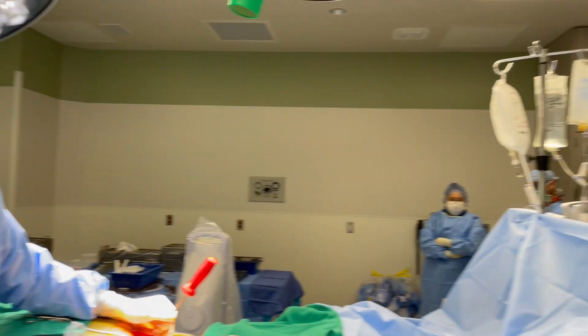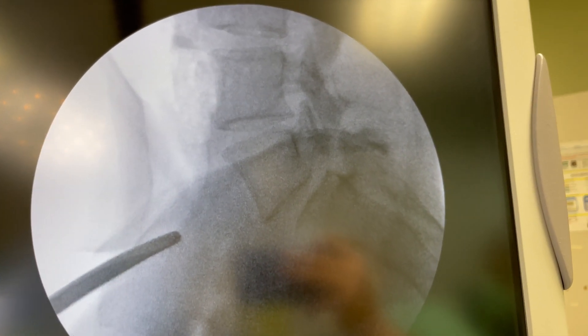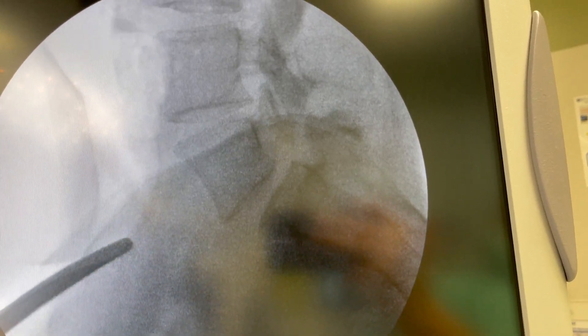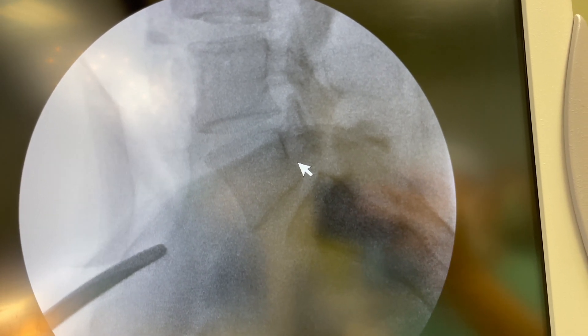The first image shows what happened when we first started. You can see that before we put any bone graft in the front and any bone screws in the back, the bone is actually shifted forward — shifted forward compared to the back of the bone below it.